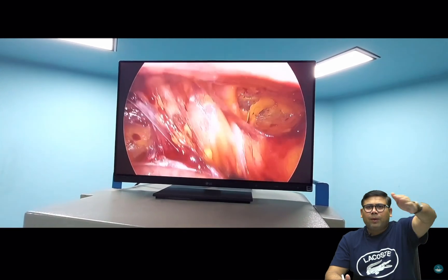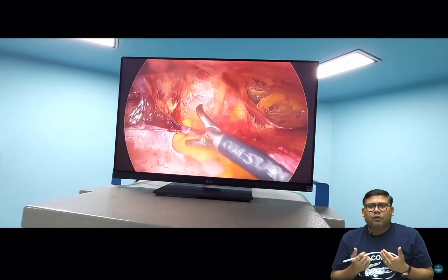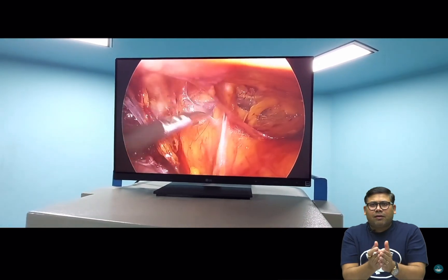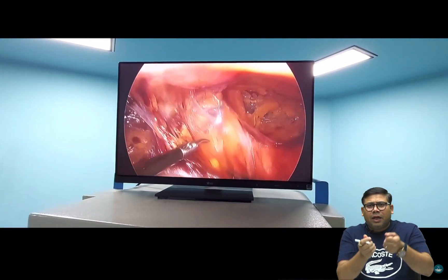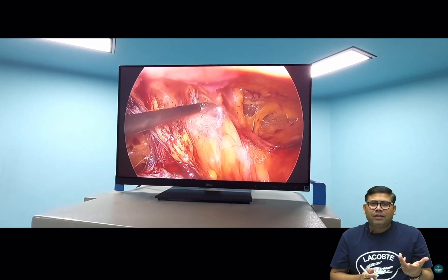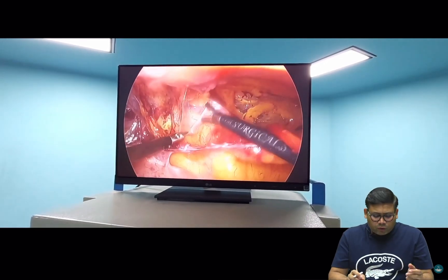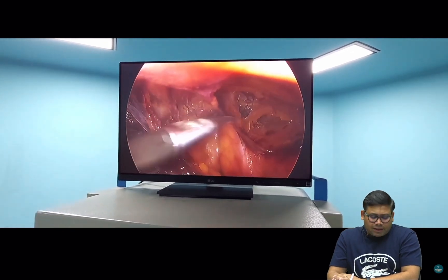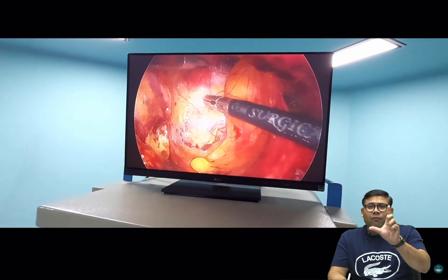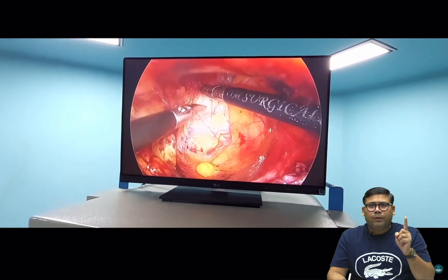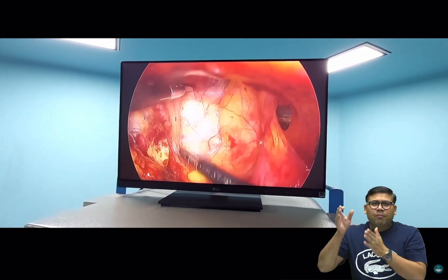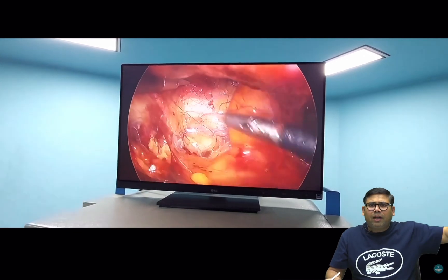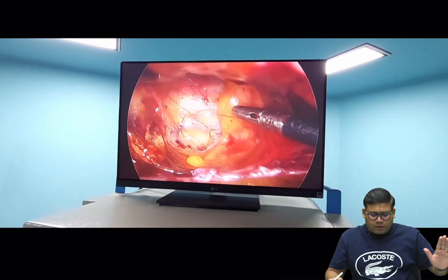As I approach the medial side I encounter the sac with adhesions. I sweep everything away rather than pulling toward me, because we can confuse fascia transversalis as a pseudo sac and damage it. You know the medial extent is complete when you see a glistening white structure — Cooper's ligament — which is your medial extent of dissection. Visualization of ASIS confirms the lateral extent.